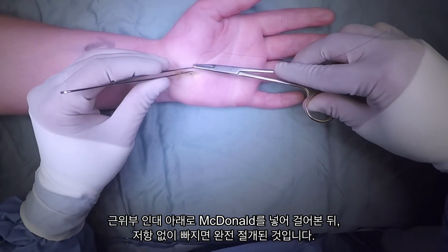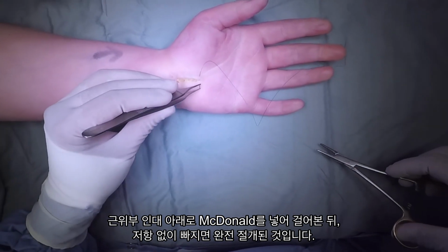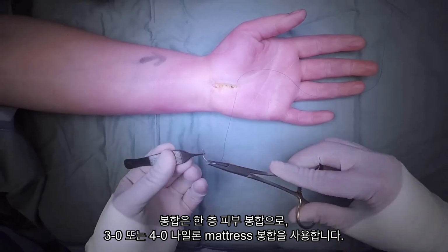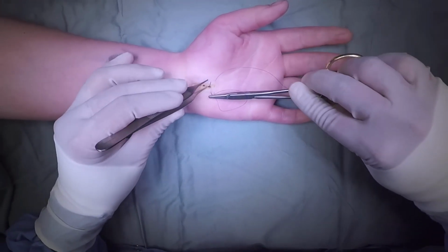We'll close the wound using a 3/0 nylon suture, though 4/0 is also commonly used. It's a single layer skin closure using interrupted horizontal or vertical mattress sutures to avoid inversion of the skin edges.